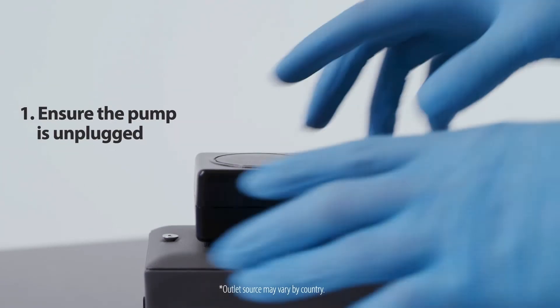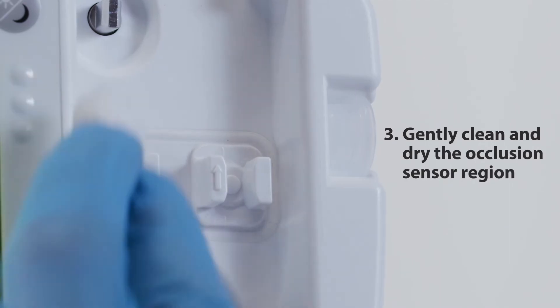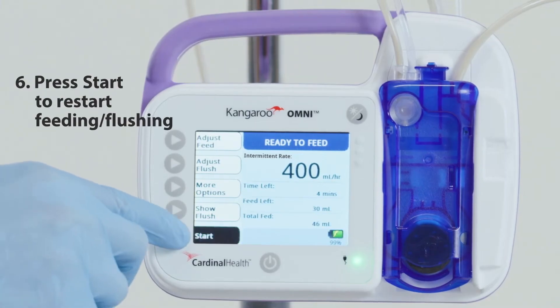If the alarm continues, first ensure the pump is unplugged from an electrical outlet. Second, remove the cassette. Third, clean and dry the occlusion sensor region. Fourth, reload the cassette. Fifth, press skip prime. Sixth, press start to restart feeding or flushing.